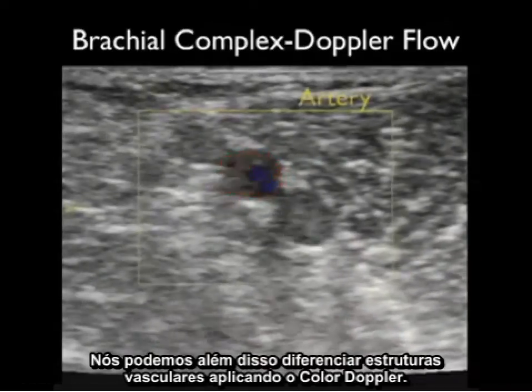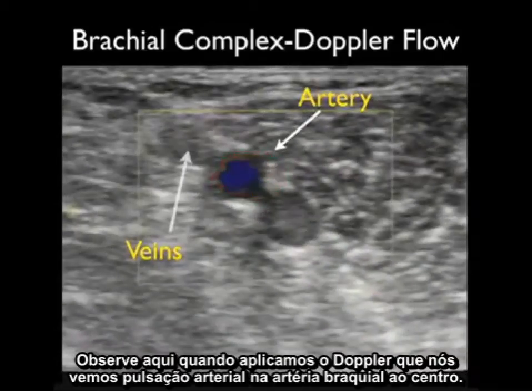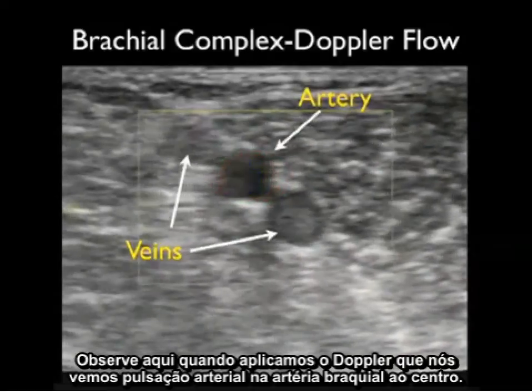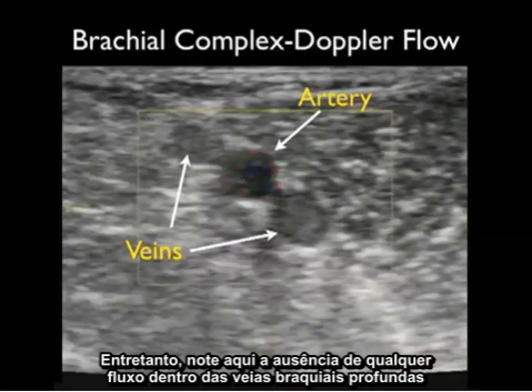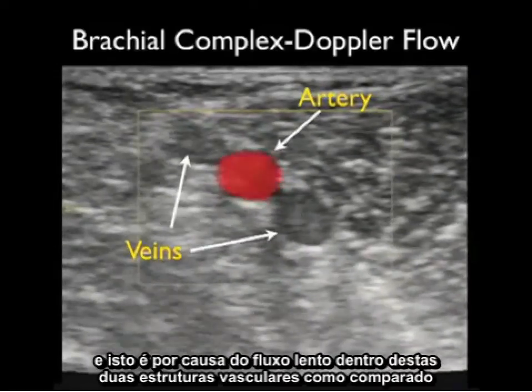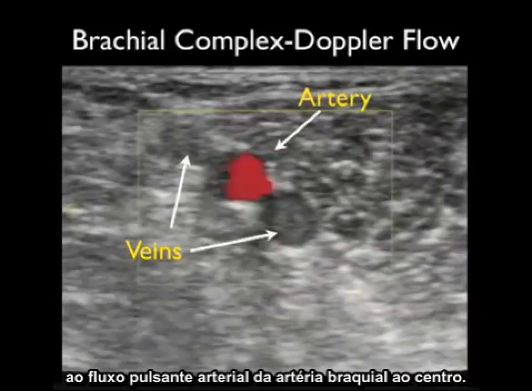We can further differentiate vascular structures by applying color Doppler flow. As we apply Doppler, we see arterial pulsations in the central brachial artery. However, notice the absence of any flow within the deep brachial veins, because of the sluggish flow within those vascular structures as compared to the brisk arterial flow in the central brachial artery.